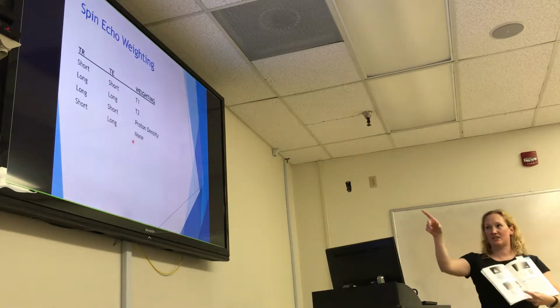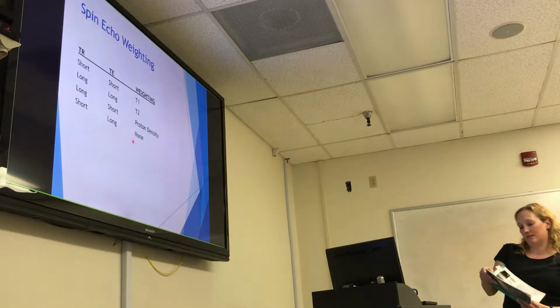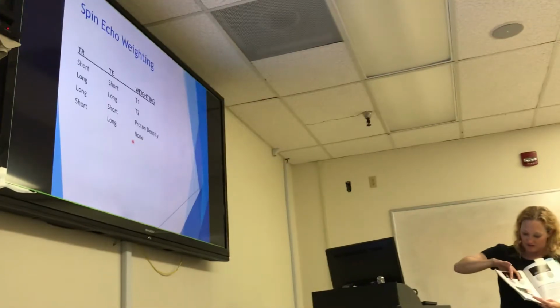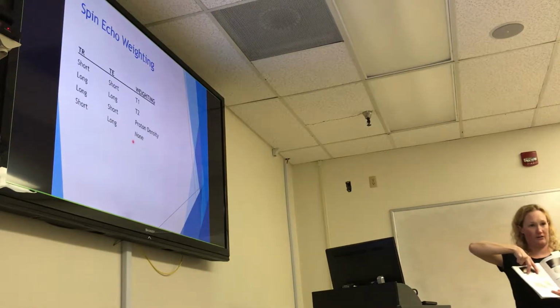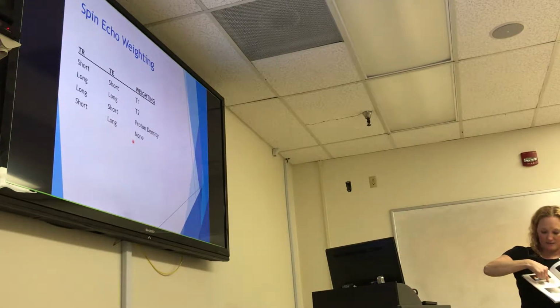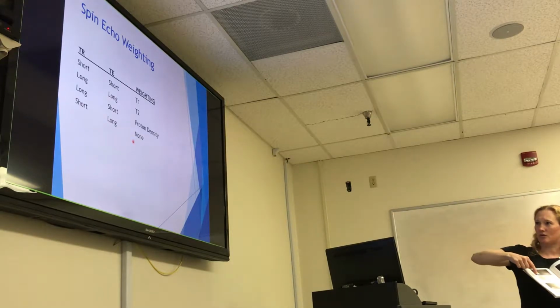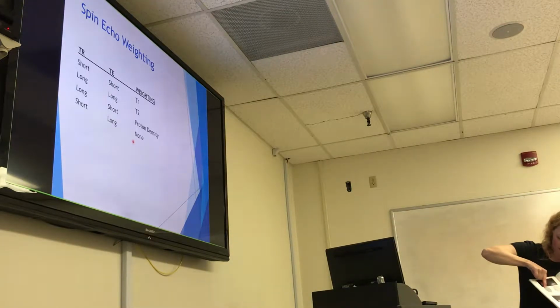So this is what this is talking about. Here on the upper left, this is our T1. We've got our two knobs, our TE and our TR, right? If we turn down our TR and turn down our TE, that's going to turn up our T1, because we want short TR and short TE to get T1. That's what this is showing you, these are pointing down.